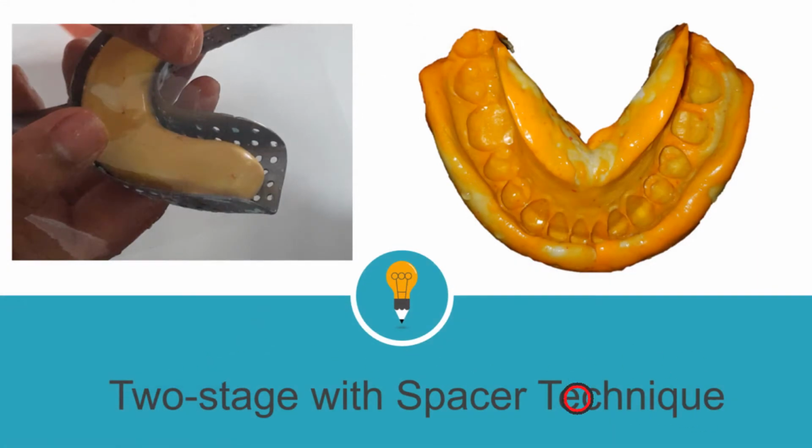Then we have two stage with spacer, okay. In two stage we have two techniques, right? With spacer, without spacer. This is with spacer. So here you can see we have a putty material. This is the putty of the C silicone. We take it, we place a cellophane sheet on top, okay, and then we take the impression without any light body, okay, only this. We take the impression. When it sets, we remove this cellophane sheet and then we inject the light body onto the set impression and also on the patient's mouth, and then we again take an impression.